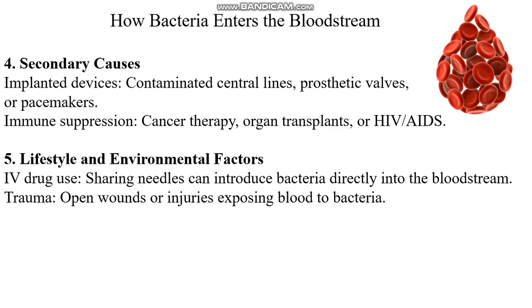So, in case we have a patient that is or has been diagnosed with septicemia, it's important that we understand the source of the infection, so we can stop the spread of the infection. We need to find the source.